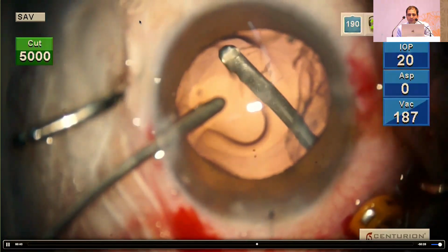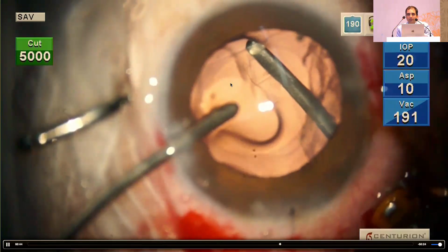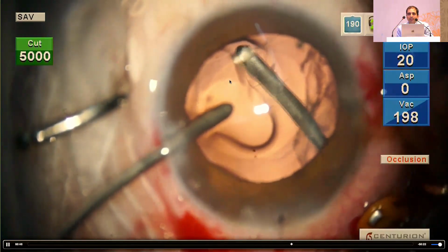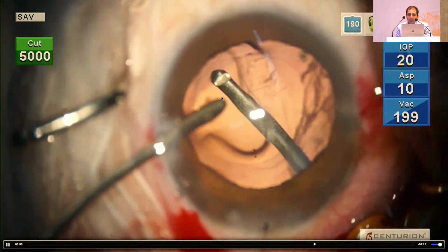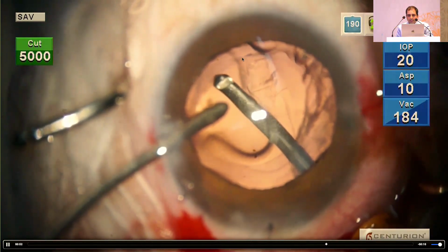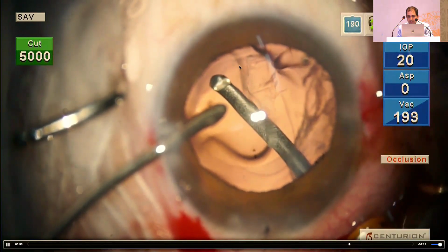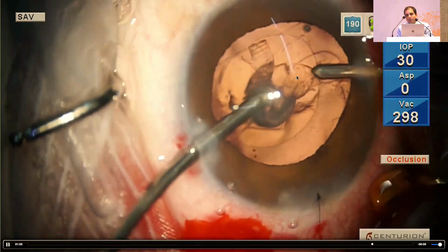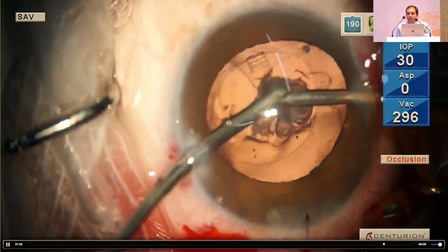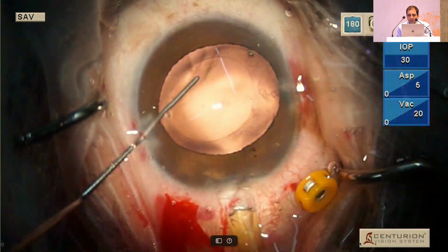You don't want to get very close to the intact posterior capsule because you can cut it very quickly if you're not used to doing a vitrectomy. So angle your vitrectomy probe a little bit more posterior. But you do need to remove vitreous even around this PCR. So the PCR is here, I'm removing some vitreous below the anterior, intact posterior capsule also. And once the vitreous has been tackled, you can go back to your bimanual irrigation aspiration as well.